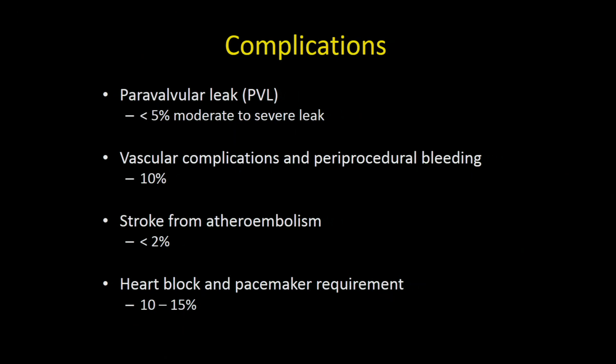Because we don't go in and cut the old valve out, there's a lot of that calcification there in the annulus that remains when we put the new valve in. It's helpful because number one, it helps keep the new valve in place. It actually acts as a good anchor. The downside is that some of that calcium, especially if it's sort of irregularly located, can allow little cracks and crevices for blood to leak through between the patient's original valve and through the prosthesis. Used to happen more often, but now with new technology, it's less common. And I'll talk about that here in just a second.